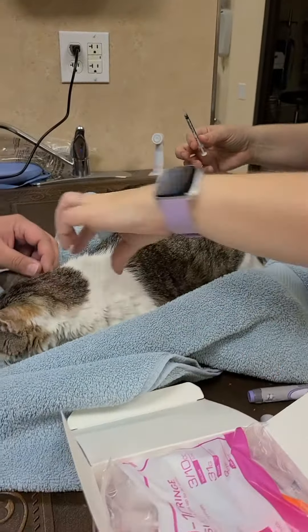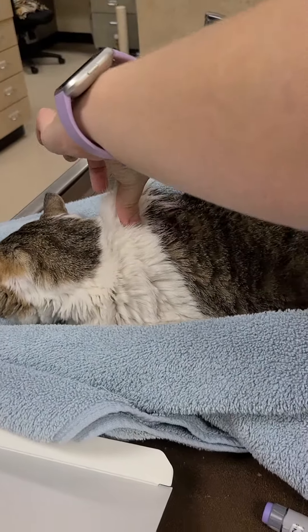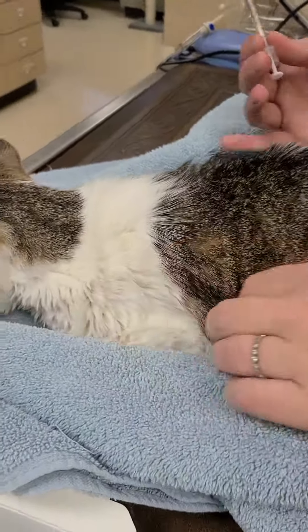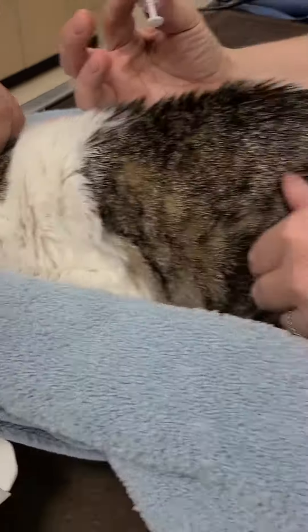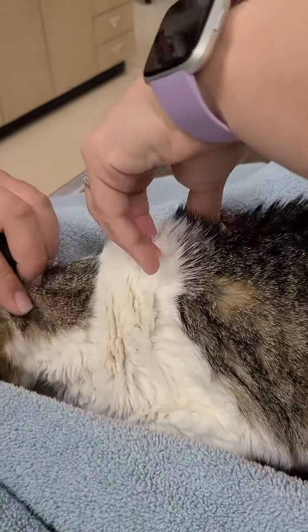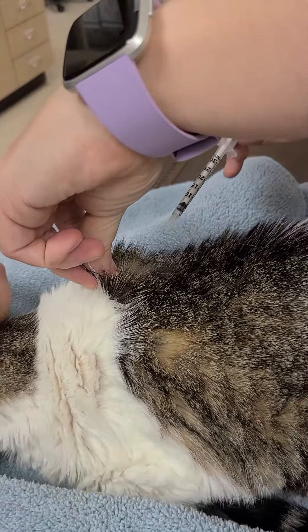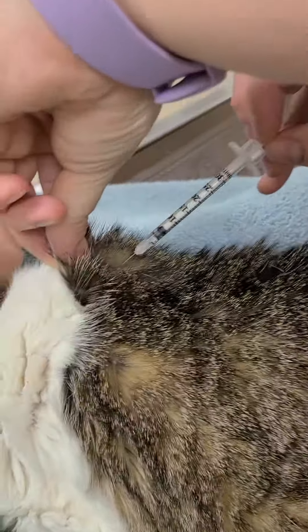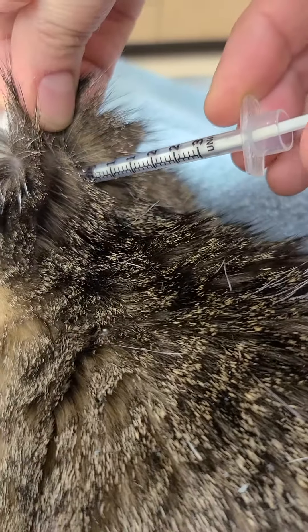And then to give her the injection, you want to grab the skin between the shoulder blades, or she might be a little sensitive down here, but you can do it over here in the belly area. I think the easiest is to go up here. Just lift the skin and then just go in and push it.